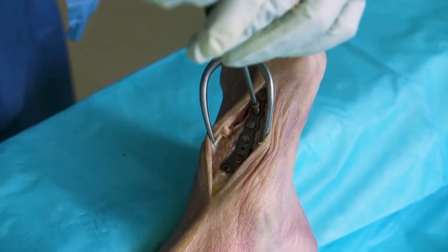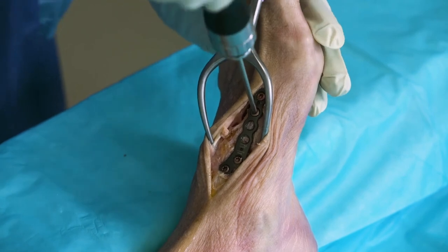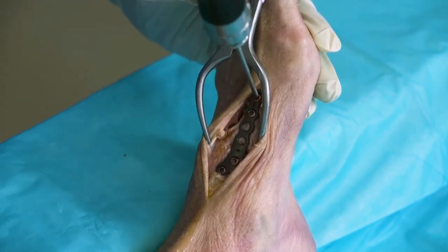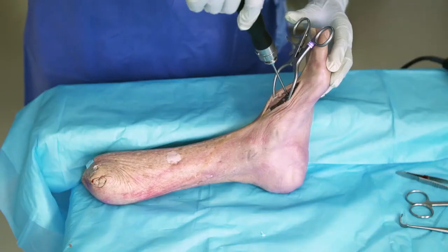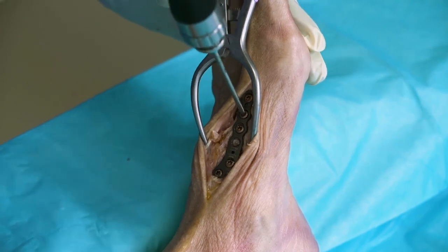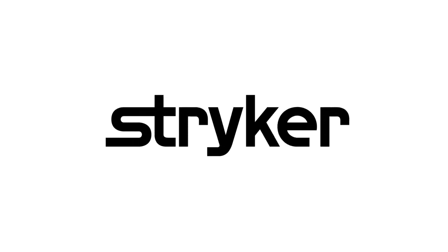Depending on the indication — whether it be a fracture or dislocation — in good healthy bone sometimes two distal screws is enough, but ideally we would get three screws distally to achieve six cortices of fixation. Because the plate contours even better as we go, we come back to tighten our most distal screw further, then put in one more screw. The plate continues to compress nicely, and there we have a nice solid fixation of our first tarsometatarsal joint.